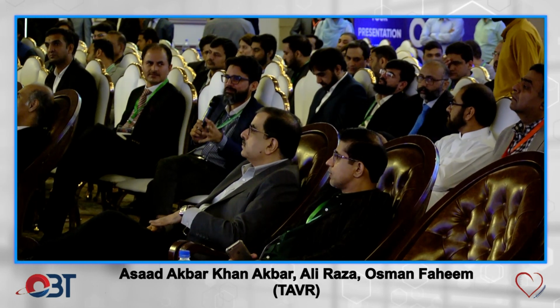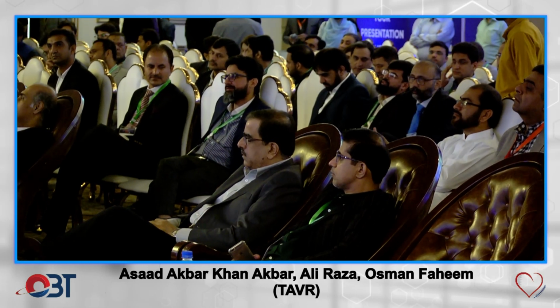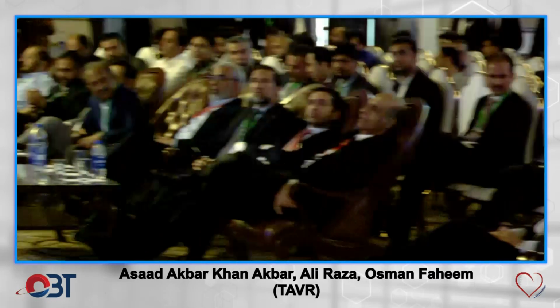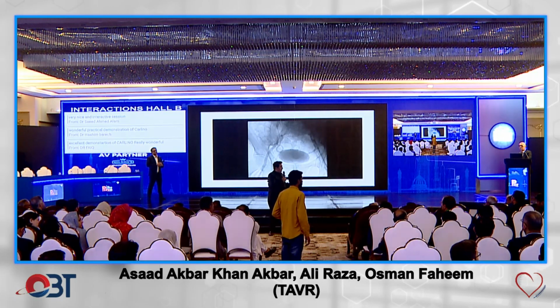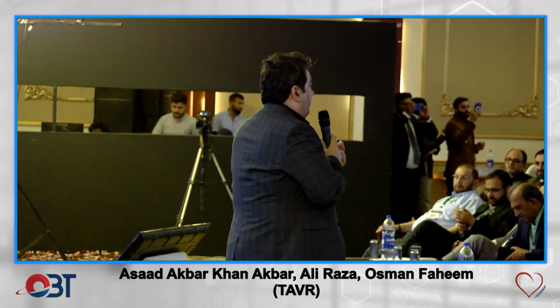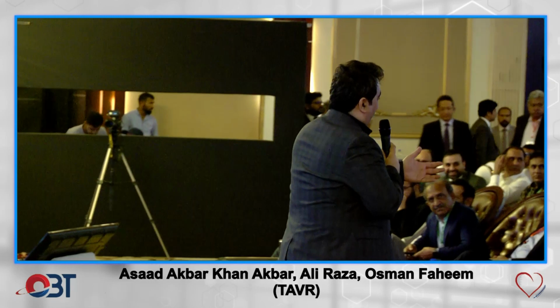You have to put the valve to get rid of the AI. We had the same case when we were doing Basilica, but that was good because the patient was in cardiac arrest and you did it so good. You did it so quickly, nothing was moving and the valve deployed so well and he improved so quickly after that. So yeah, sometimes it's good.